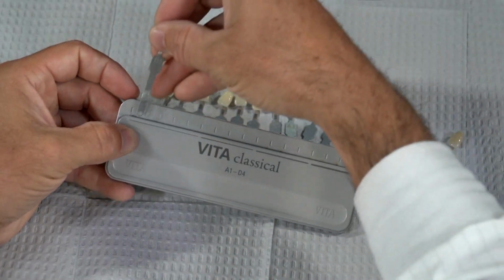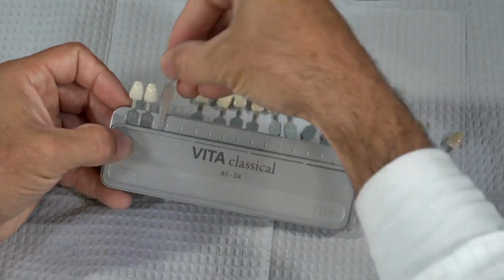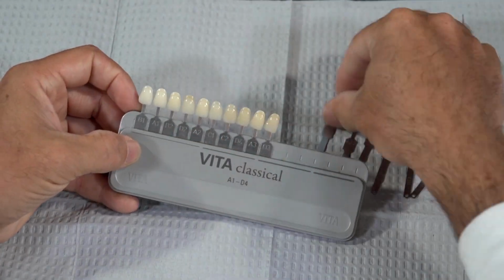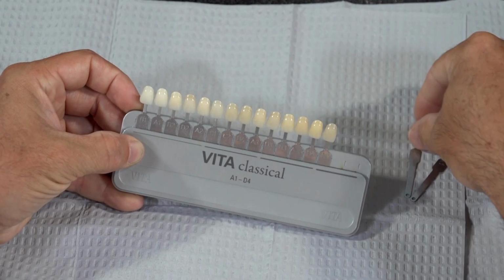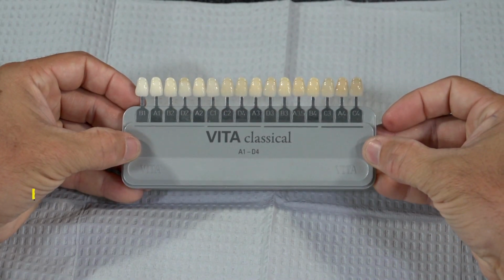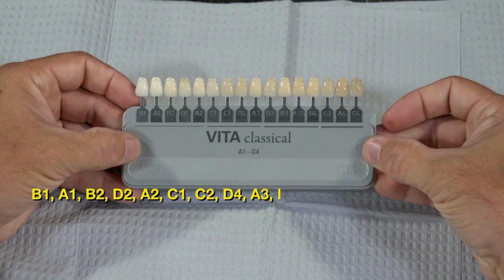Contrary to the alphabetical order that it's set up in, when talking about shades on the Vita Guide, we all know that B1 holds a brighter hue than A1 or A2. The new arrangement of your tabs when replacing them should be, from left to right, B1, A1, B2, D2, A2, C1, C2, D4, A3, D3, B3, A3.5, B4, C3, A4, and C4.